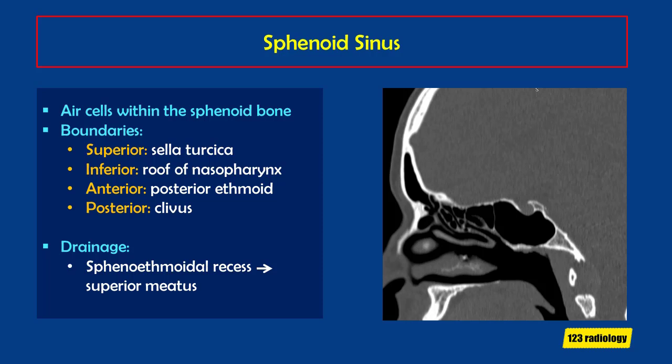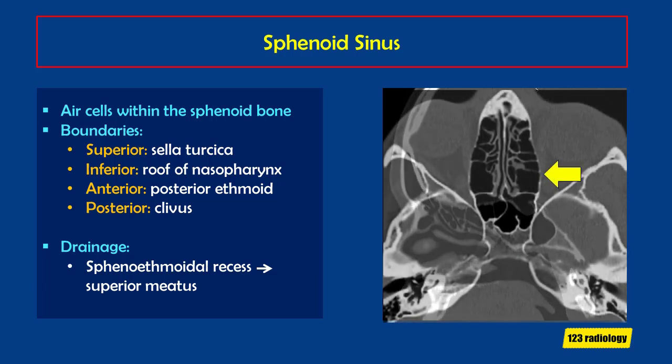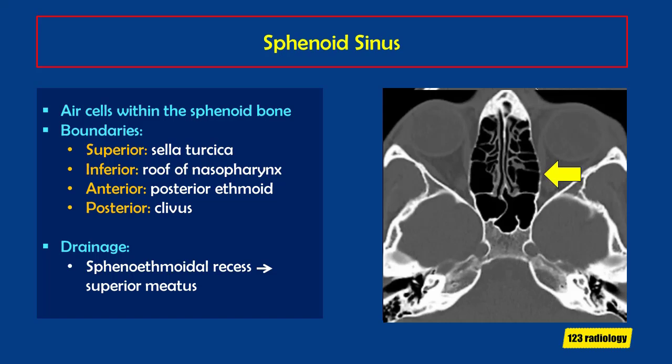The sphenoid sinus is the air cell within the sphenoid bone. It is bounded superiorly by the sella turcica, inferiorly by the roof of the nasopharynx, anteriorly by the posterior ethmoid air cells, and posteriorly by the clivus. It drains to the superior meatus via the sphenoethmoidal recess.